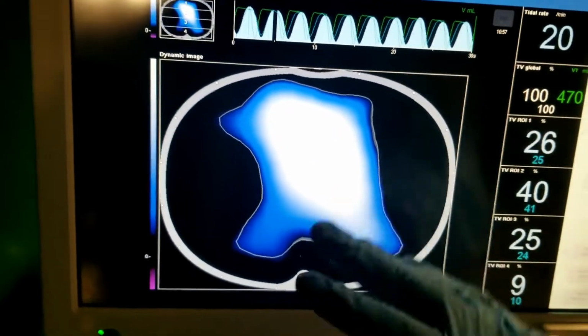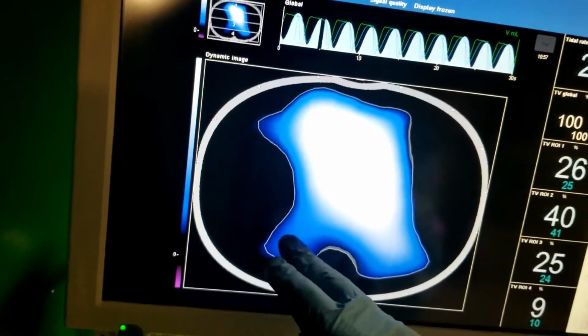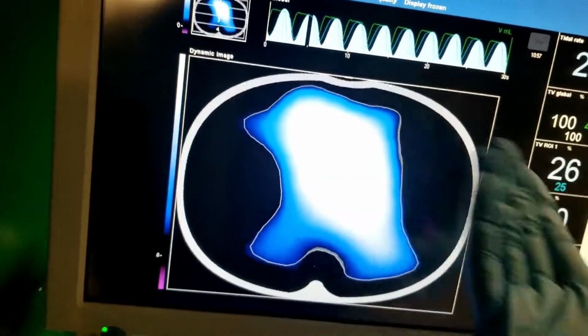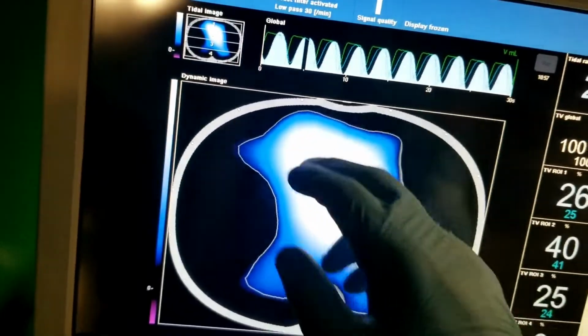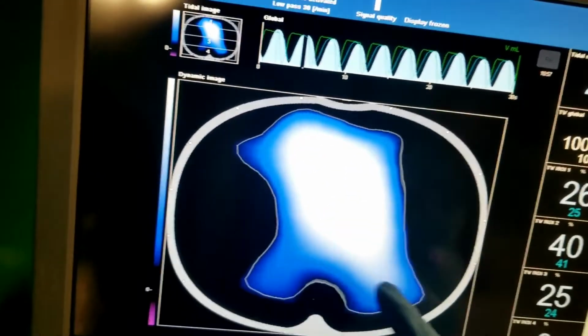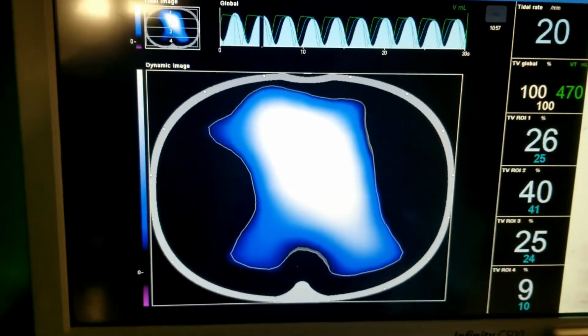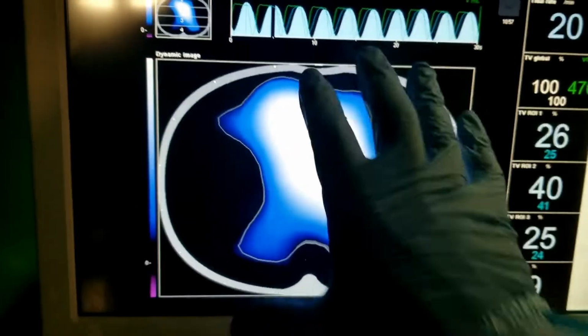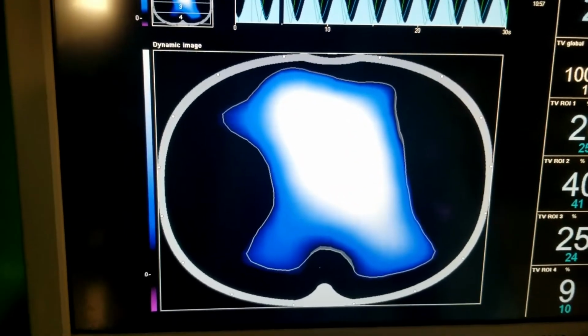Hey, let's bring down the pressure or the power of the vent, and let's see if I'm losing here or if I'm losing here. Probably if I start losing the intensity of the maximum ventilation in the upper regions without losing, that's a really quick indicator if you're in a hurry to know that, yeah, it's giving me some information that maybe it's a good idea to try and wean down these pressures.